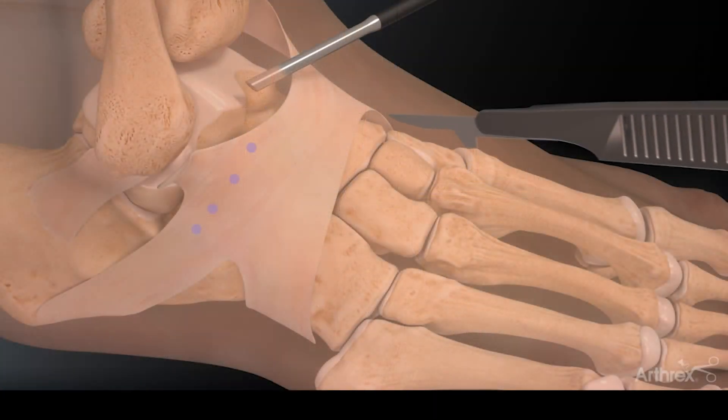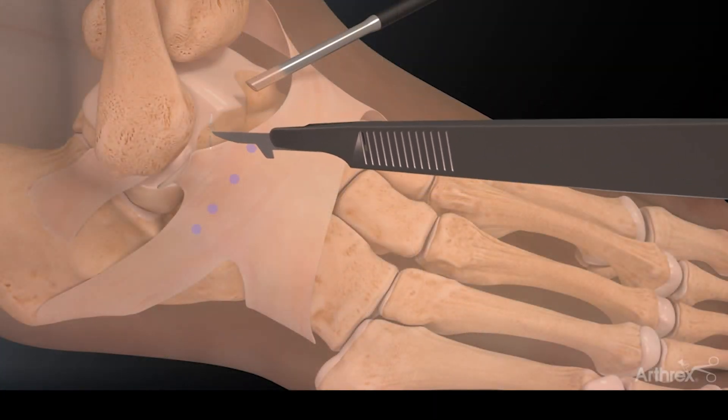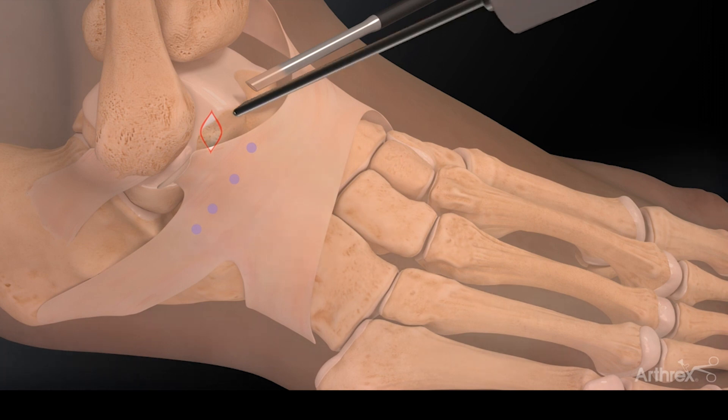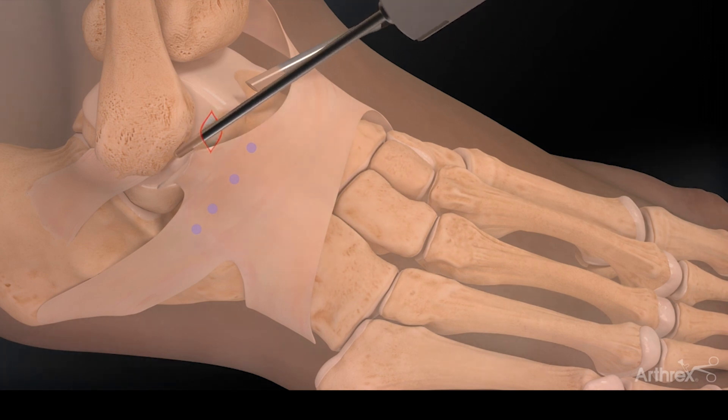The neat thing about it is it's a minimally invasive way to treat ankle issues. What it entails is small incisions along the front of the ankle where we use a camera and a tool to clean out the inflammation that could be caused from instability, ankle arthritis, or trauma.